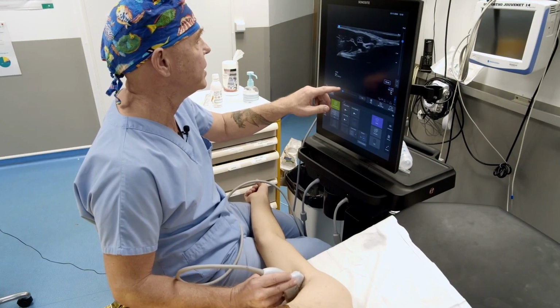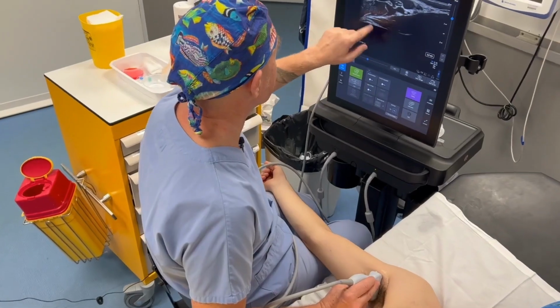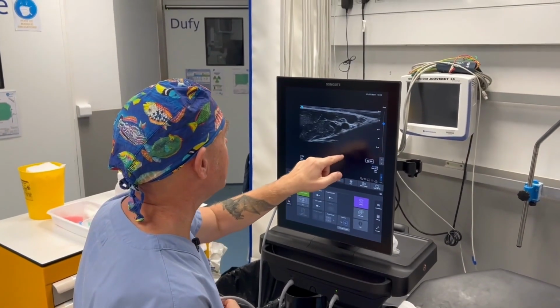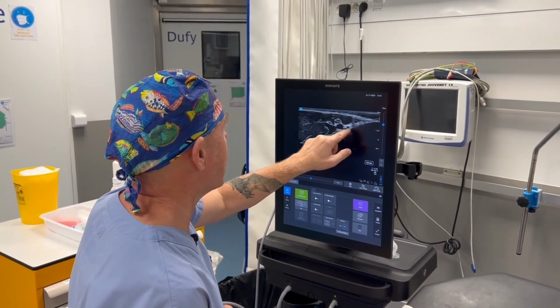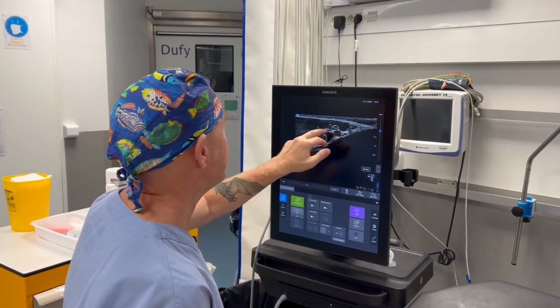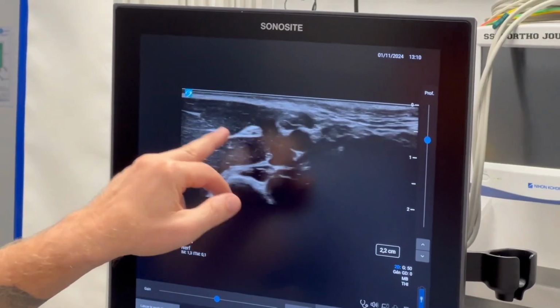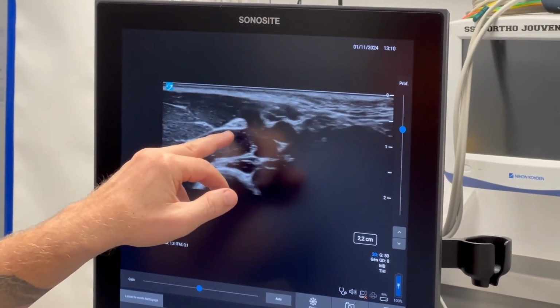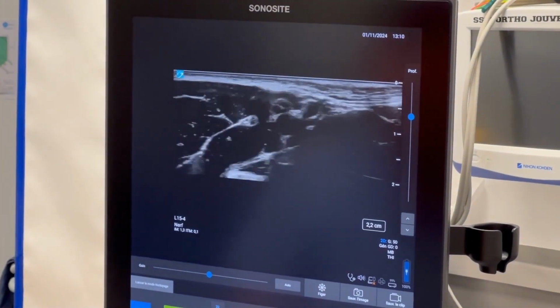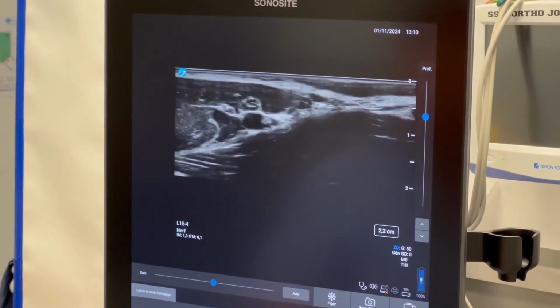So to be a bit more didactic, we'll do it this way. You see the main landmarks we saw earlier, namely the bone and the skin, the tendon of the latissimus dorsi, the radial nerve, which is always located above at this level, and then the musculocutaneous nerve. Now the more characteristic image would be to have the musculocutaneous nerve between the biceps and the coracobrachialis. Well, this is part of anatomical variations.